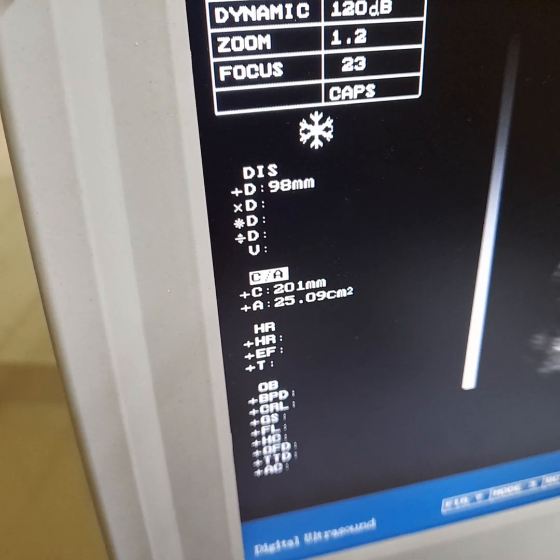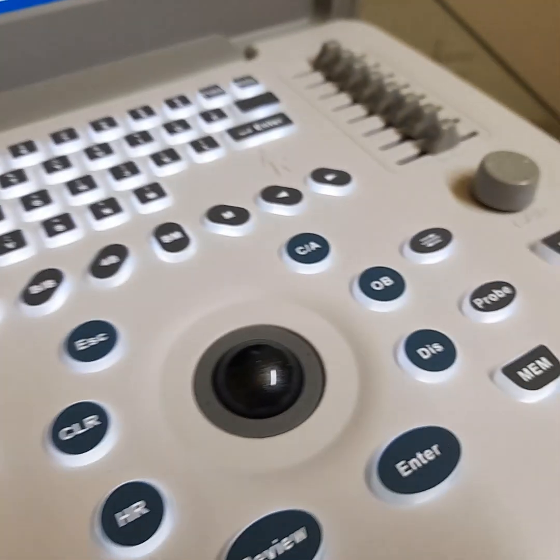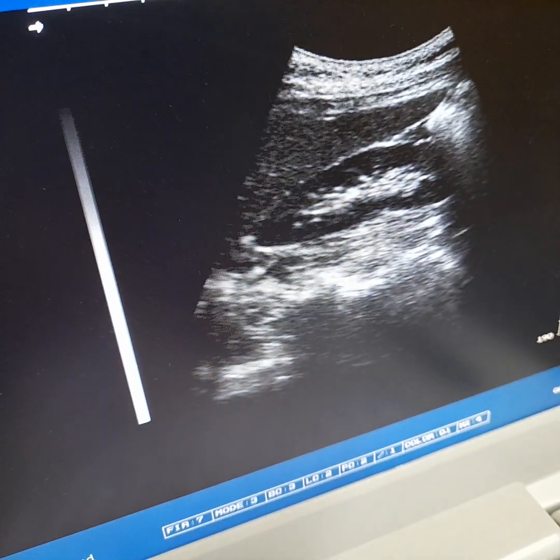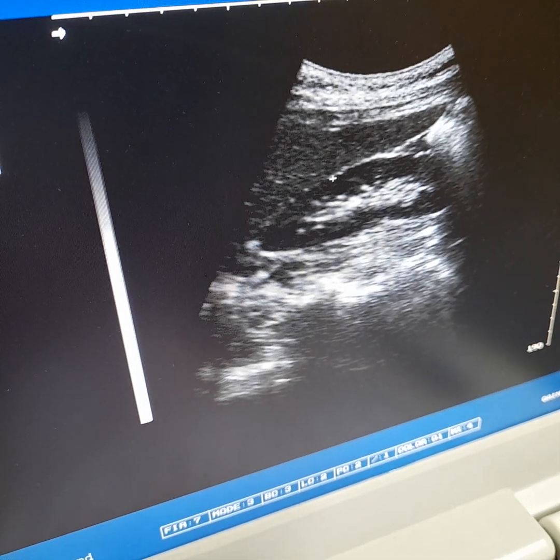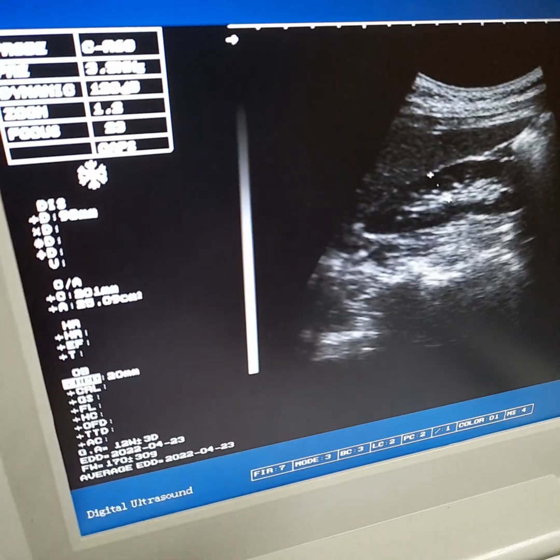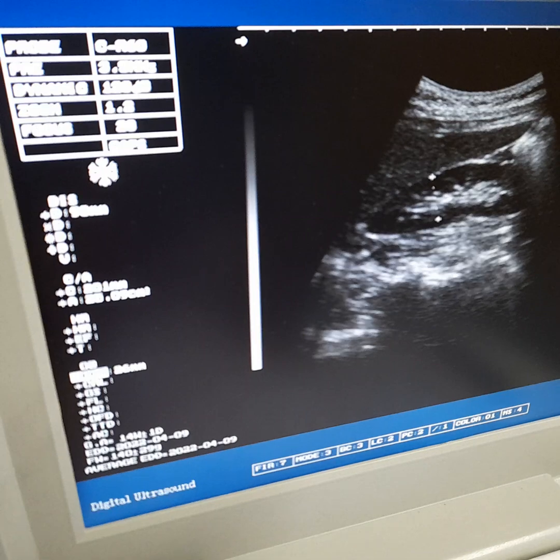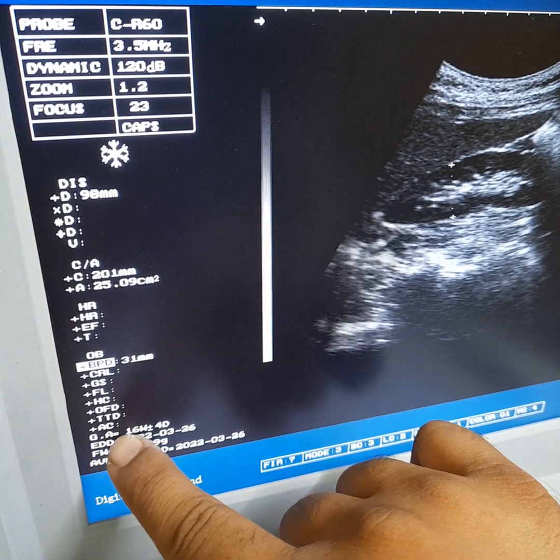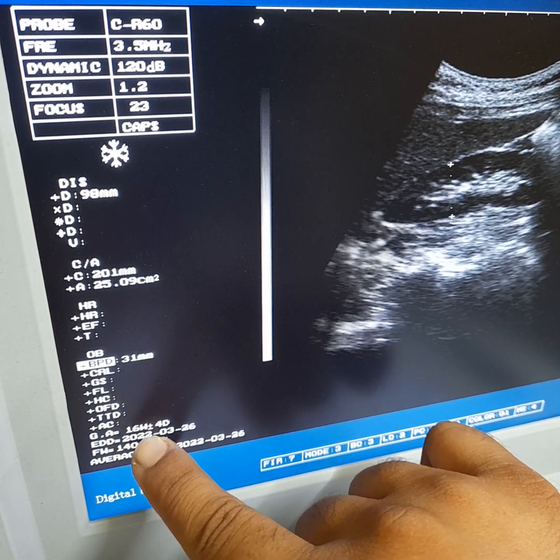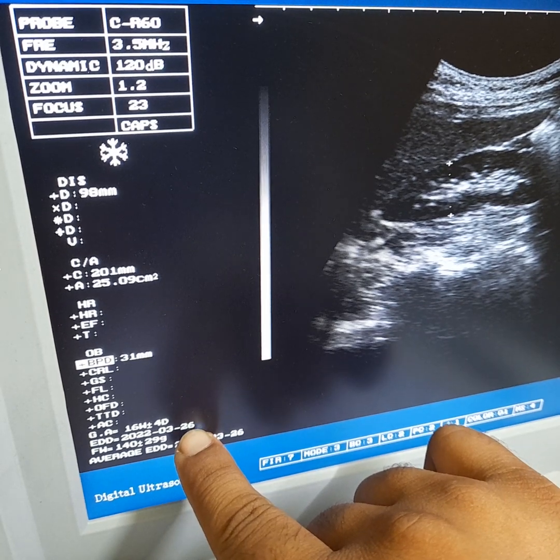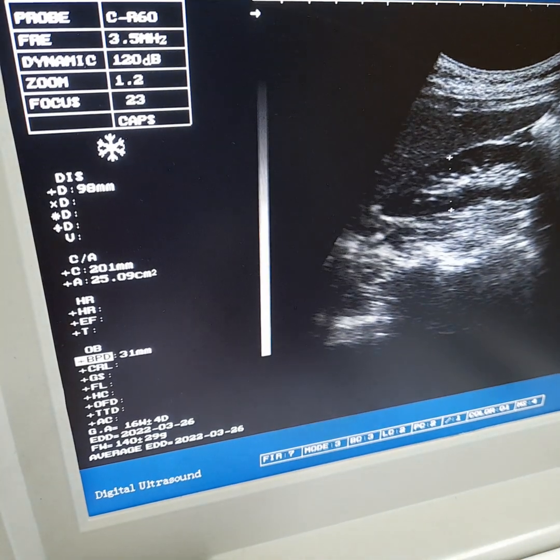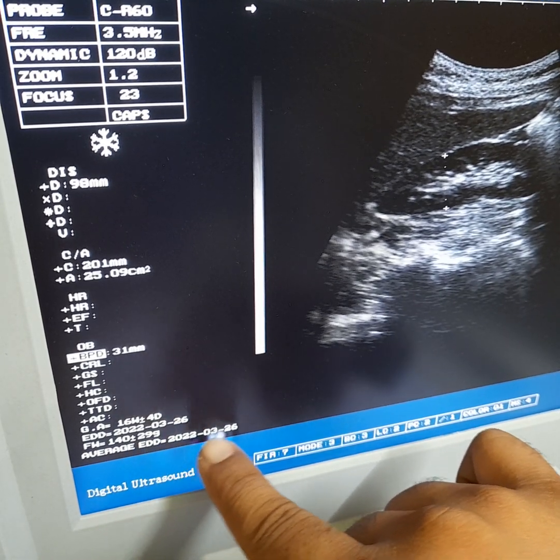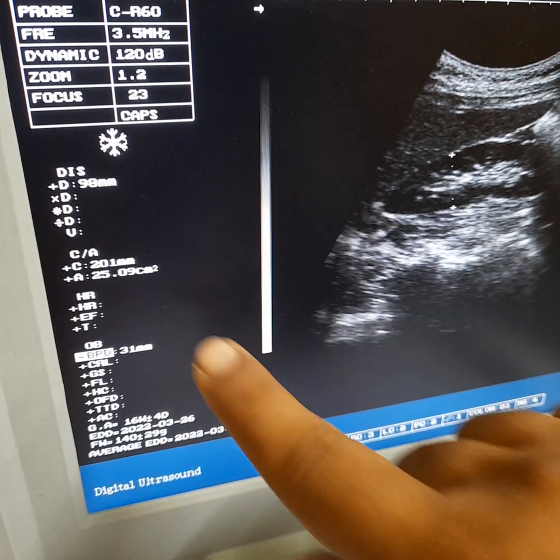For obstetric measurements, press the Obstetric button. The first selection is BPD — move your trackball and press Enter. You can see the measurement results: 31mm length, gestational age 16 weeks, EDD 26/03/2020. Below is the fetal weight: 140 plus or minus 29 grams. The average EDD date is 26/03/2020.